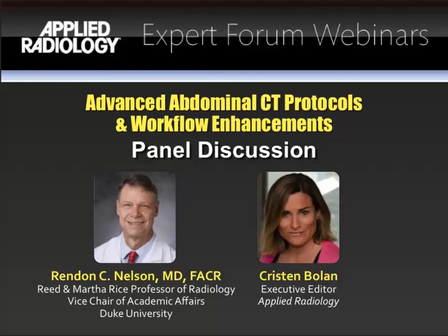In terms of timing, I don't know that it's a whole lot different if they're an hour apart versus 2 hours apart. I suspect that the half-life of the contrast media is pretty quick, so waiting an hour or two probably gets most of the contrast out of the system within that time period, so that's probably adequate for most applications. Okay, thank you. And some more questions.